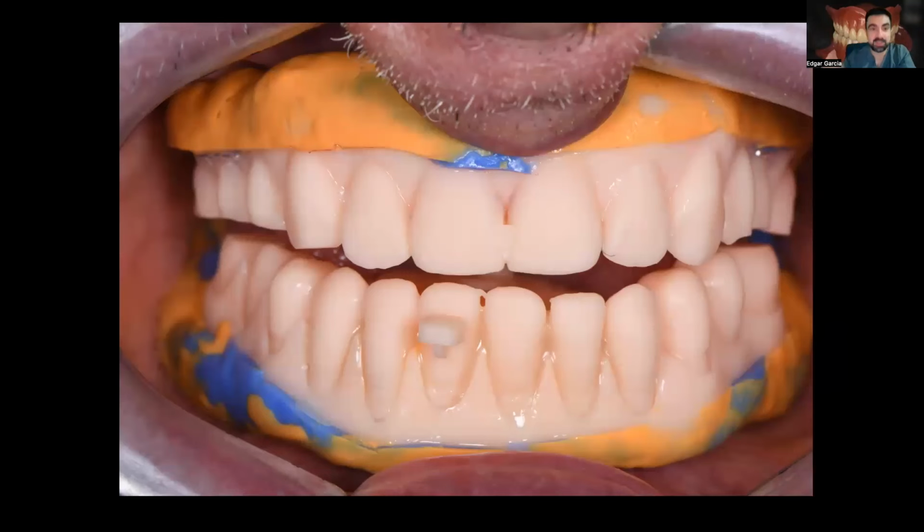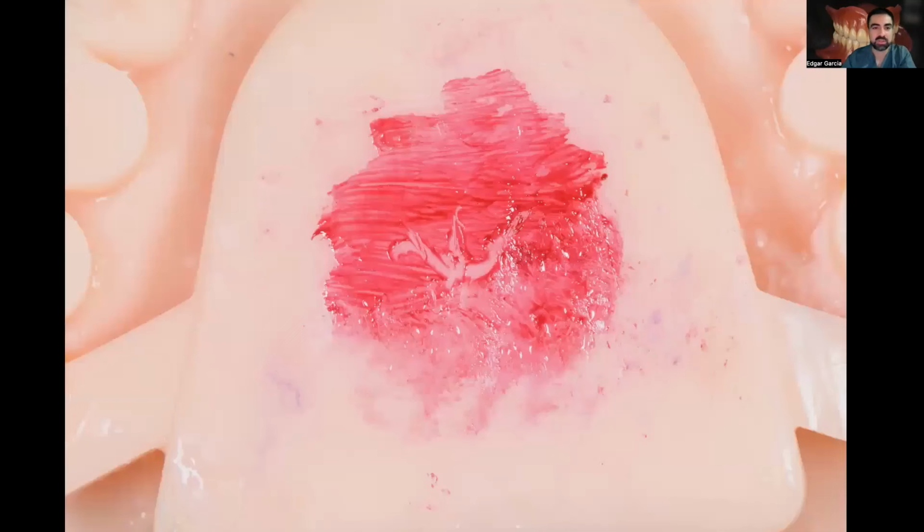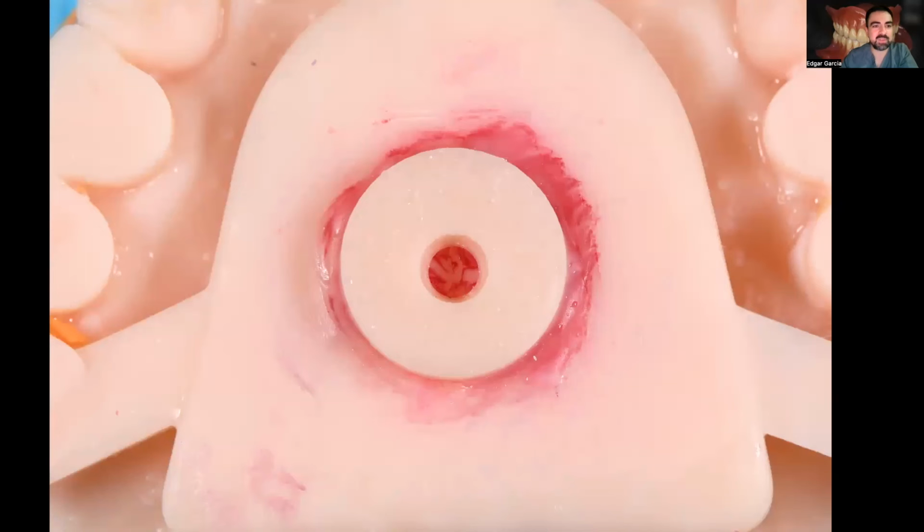I do the tracing technique that we talked about before. Here are the movements that the patient did. This was the best tracing that I obtained with the patient. So here at the center of it, I put flowable resin, and I obtained my occlusal registration. Perfect. And I did my dentures like this. Yeah, that's a great idea. Very, very nice.